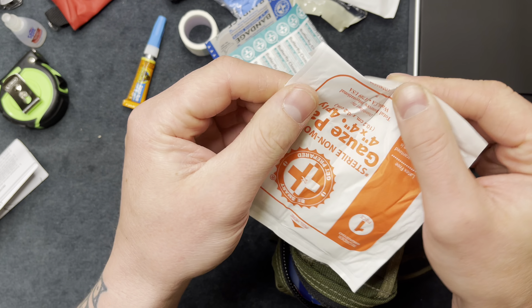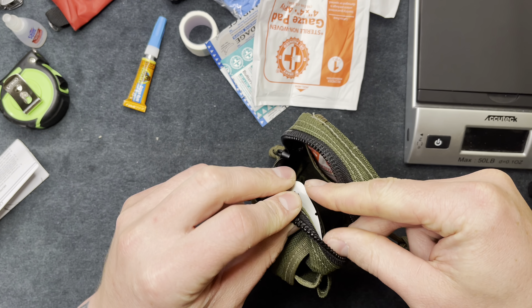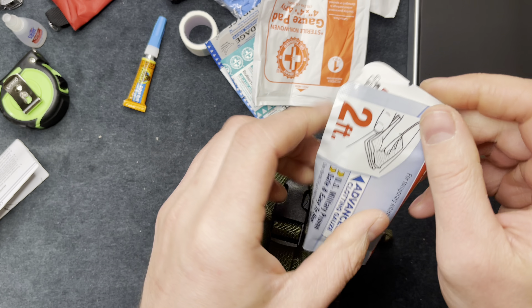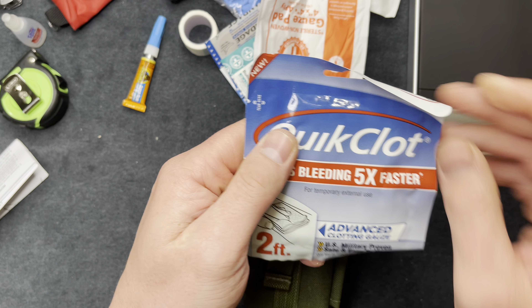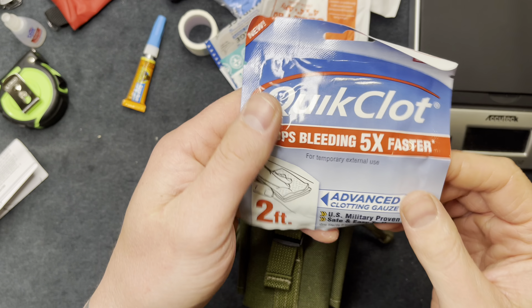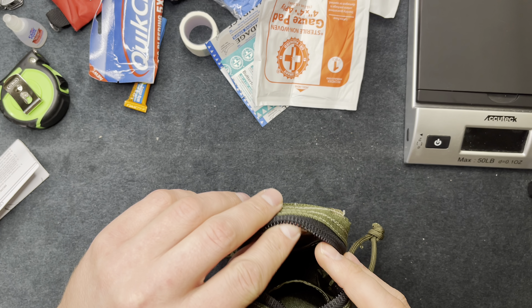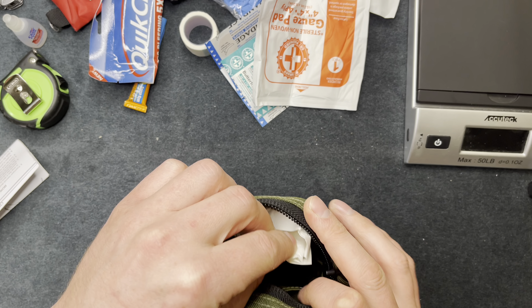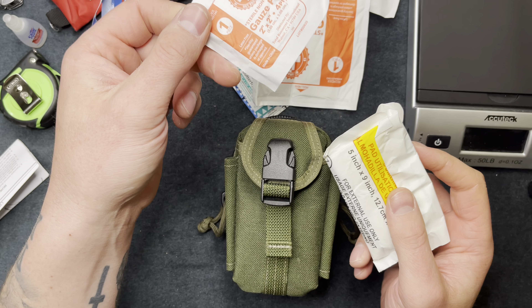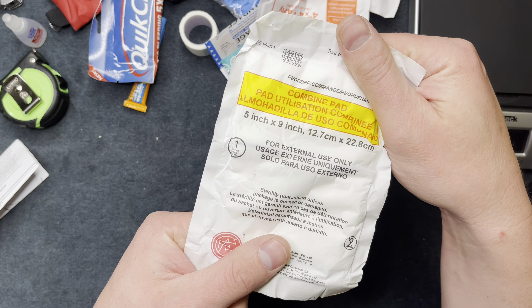Here I have a four-by-four gauze pad. I also have some QuikClot — I'd like to get the four-foot version or more of these, but this will do for now. Here I have a two-by-two gauze pad and a combine pad as well.